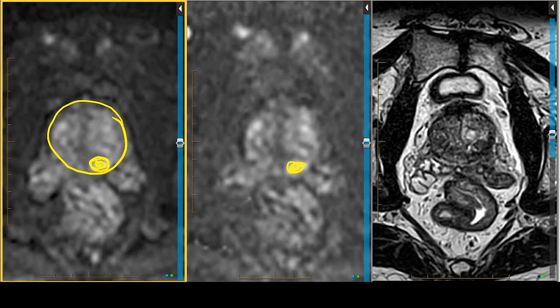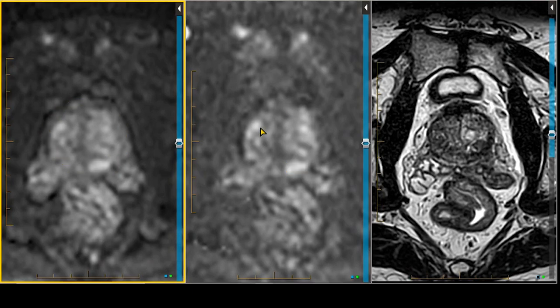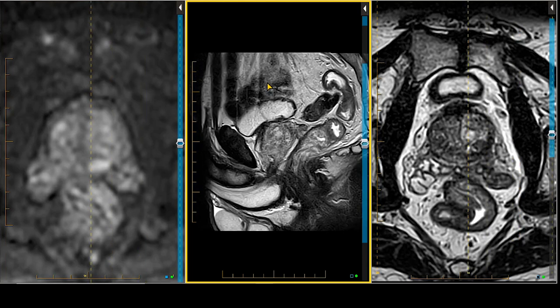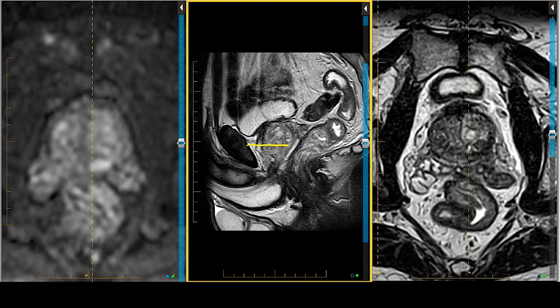Another important caveat described in PI-RADS 2.1 is acquisition angle. Let's pull down the sagittal — you can either acquire with a direct orthogonal, in other words a straight axial like this, or you could be perpendicular to the long axis of the prostate, like this. Either way is fine.